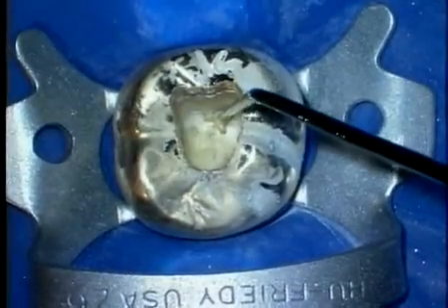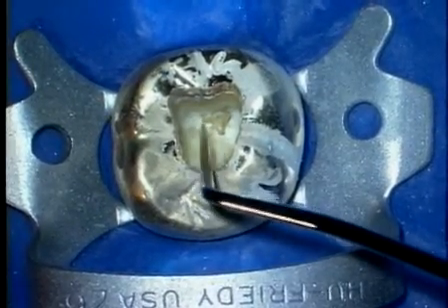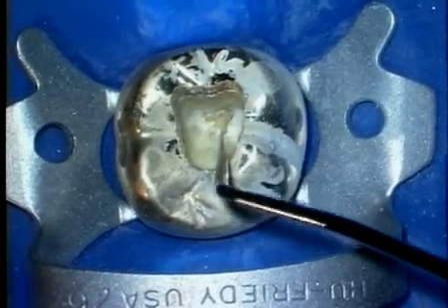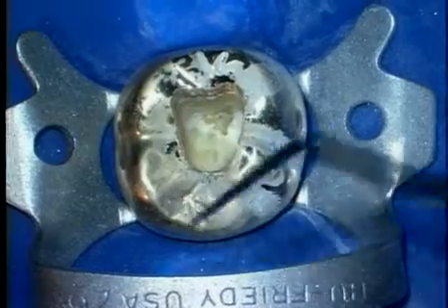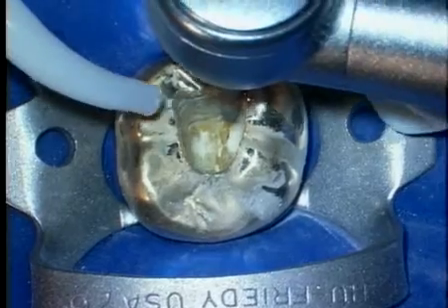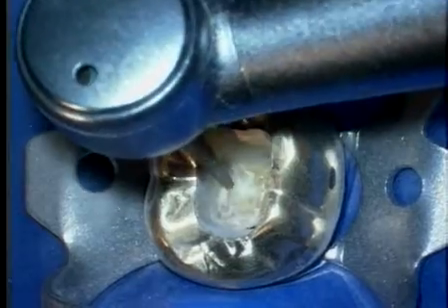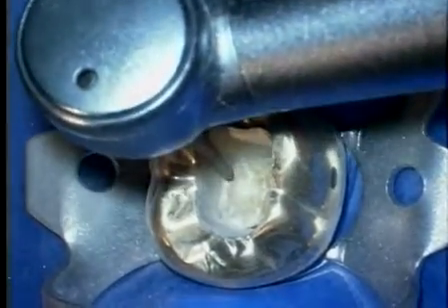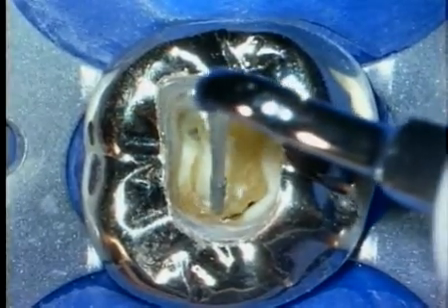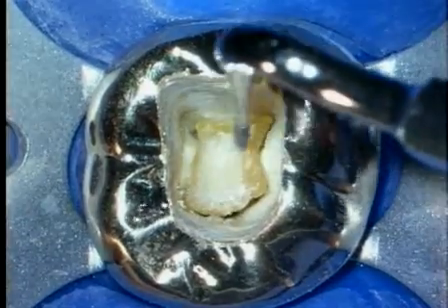You can see quite an island that appears to be quite a large denticle. Notice the color distinction between this large stone and the surrounding dentin. Sometimes you can just elevate these things out with an Explorer, but if they're large, then you better do more access refinements. A surgical length tapered diamond is used to smooth up the axial walls and make them nice and flat. This refracts light excellently and improves vision. Ultrasonics is an excellent way to blow out a lot of these big stones and free them up so they can be liberated.